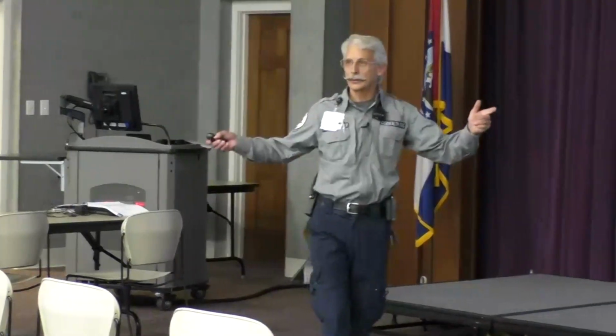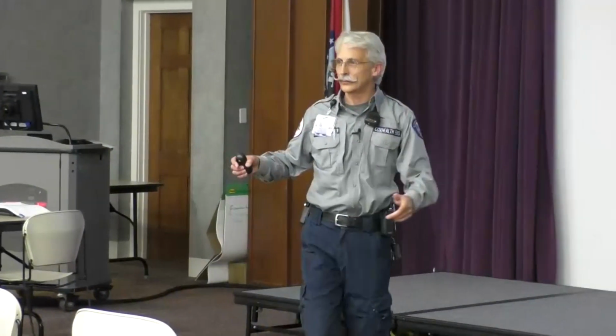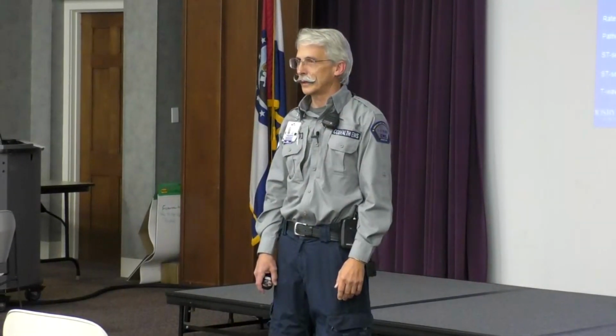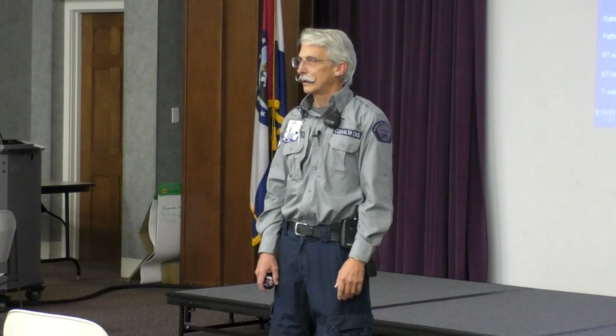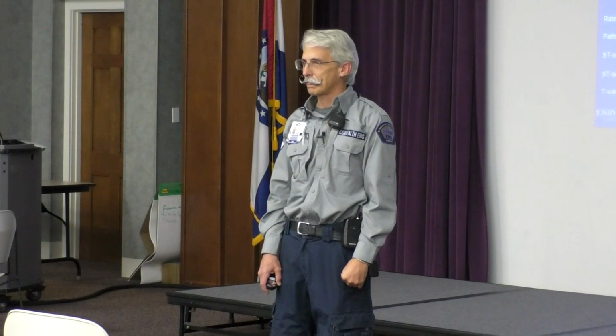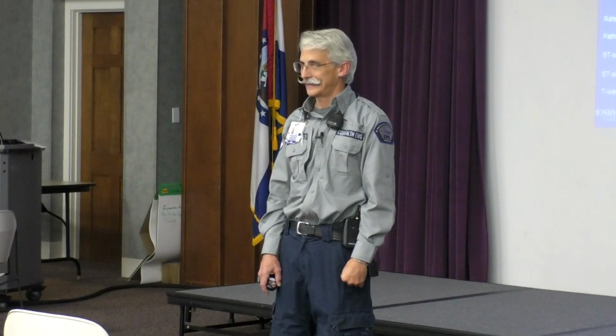Another quick question while I'm thinking of it. You're just looking at your monitor, and you got a LifePak 15 or a 12, and you can see 3 leads on there, and they may or may not have elevation or depression. Does it mean anything if they have elevation in those leads? It does not.